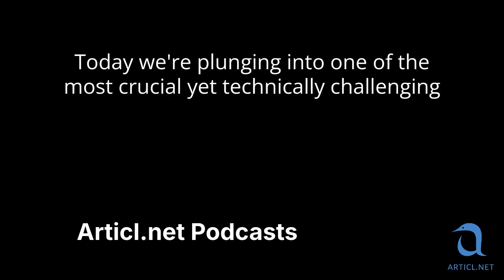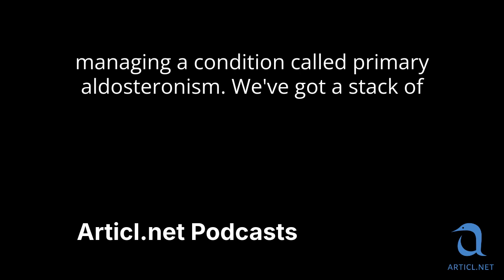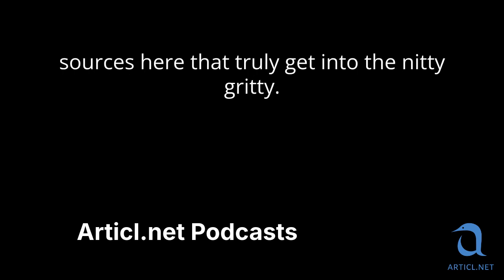Great to be here. Today, we're plunging into one of the most crucial yet technically challenging procedures for us as interventional radiologists, adrenal vein sampling, or AVS. It's often called the gold standard for a reason, especially when it comes to managing a condition called primary aldosteronism. We've got a stack of sources here that truly get into the nitty-gritty.